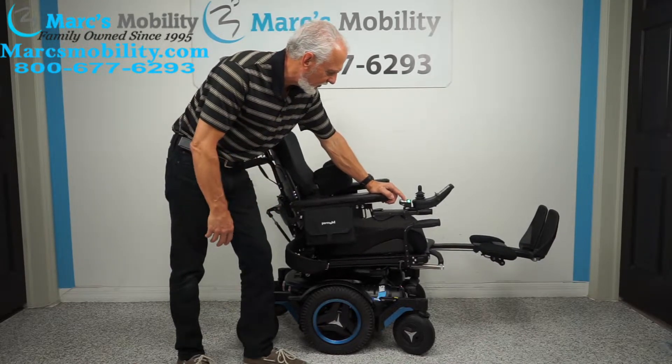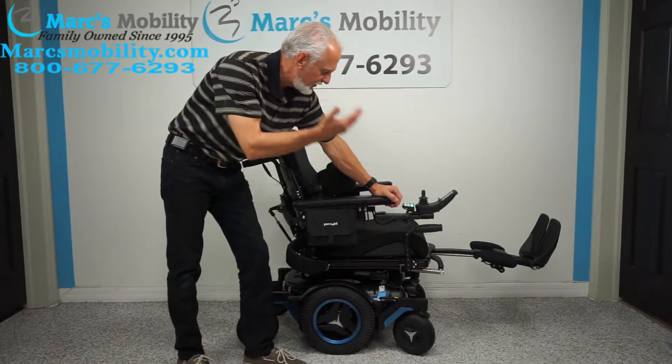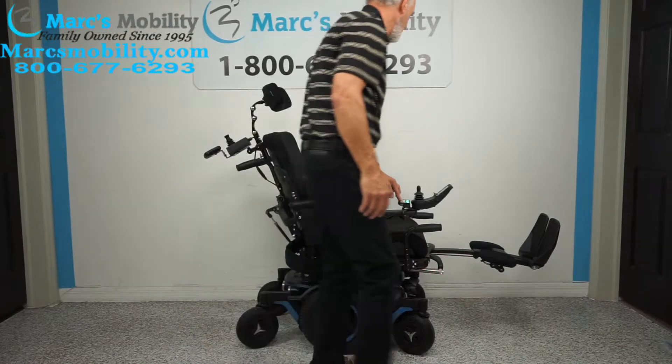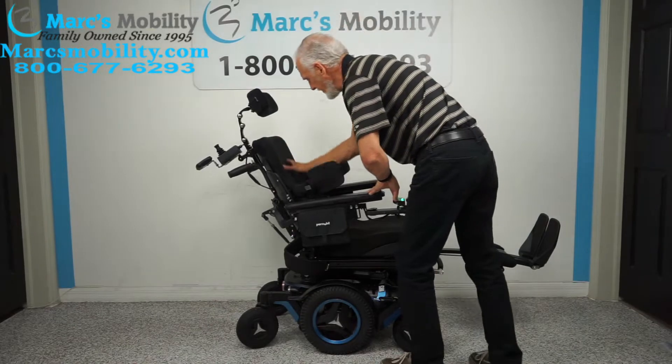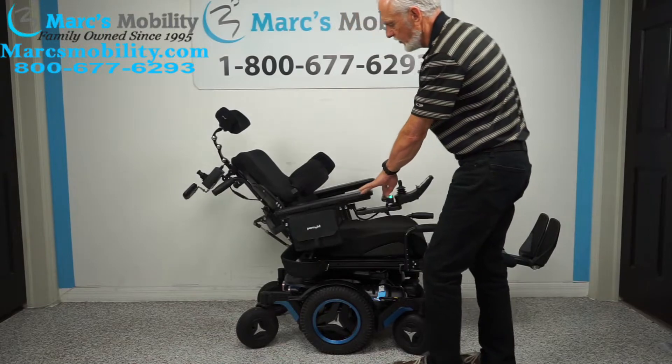We've done three functions so far: the seat lift, the tilt, and the legs. Now we're going to do the recline. The recline is when just this back part goes back — nothing else is moving. This is called recline.